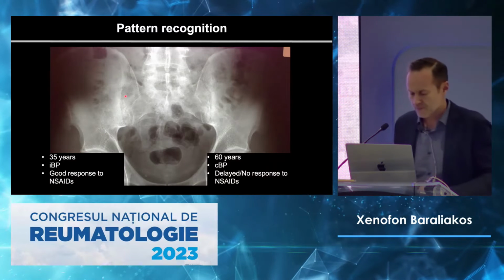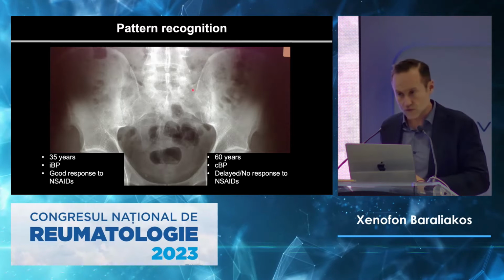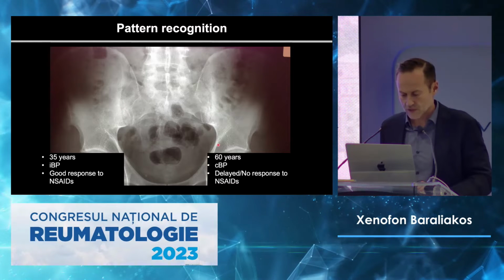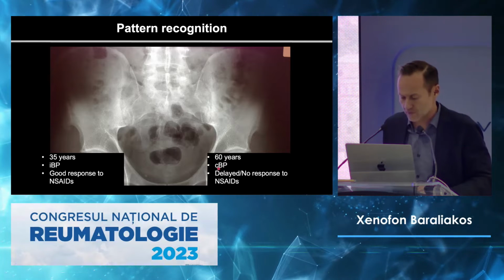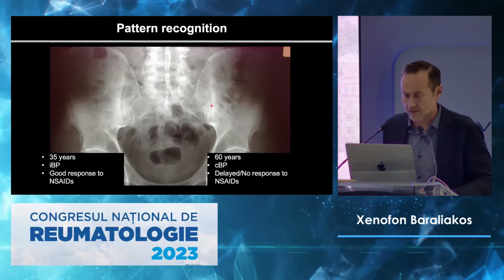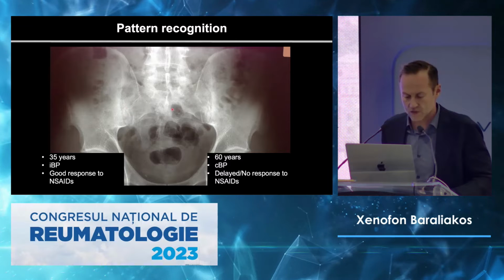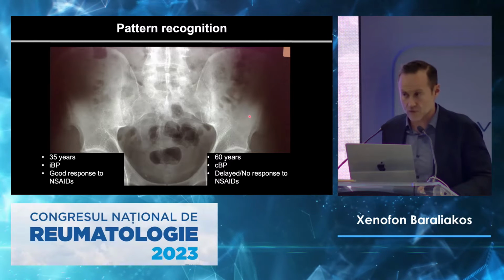So it's overall depending on what the symptoms are, how old the patient is, and how you did the X-ray. In a 35-year-old patient with inflammatory back pain, it's different, that sacroiliac joint, as compared to a 60-plus-year-old person with chronic back pain and no really typical symptoms or findings. This might be erosive but degenerative in the older person, 70-plus if you want to say, and this is obviously both strongly pathologic in a younger person with inflammatory symptoms.